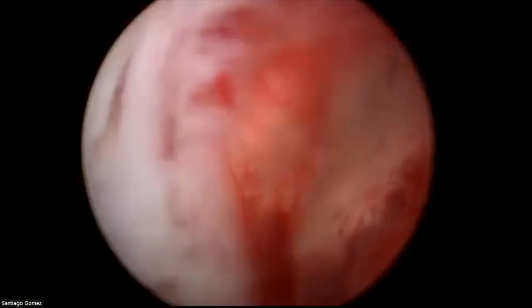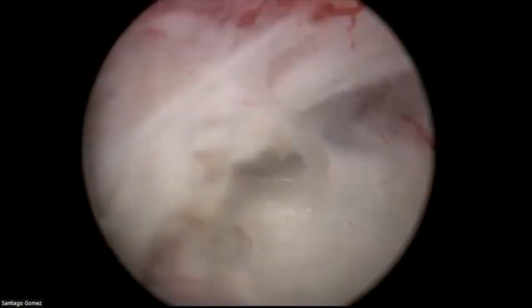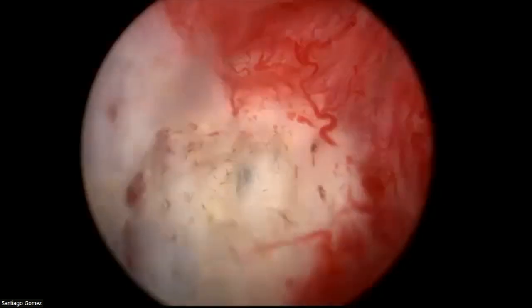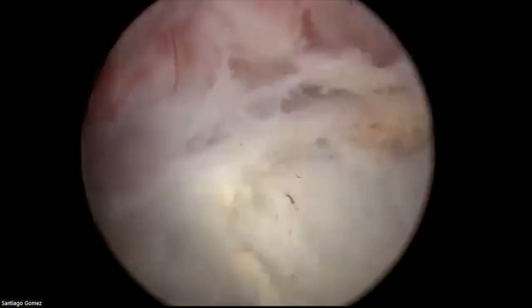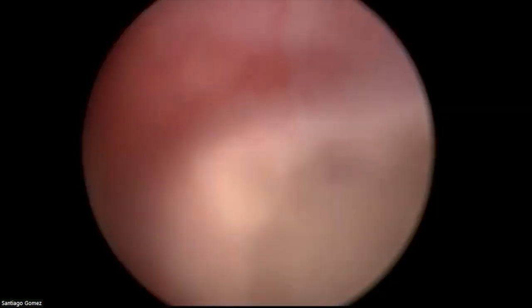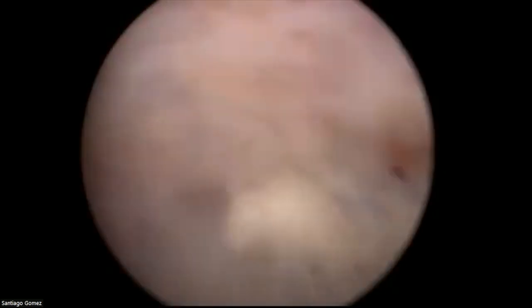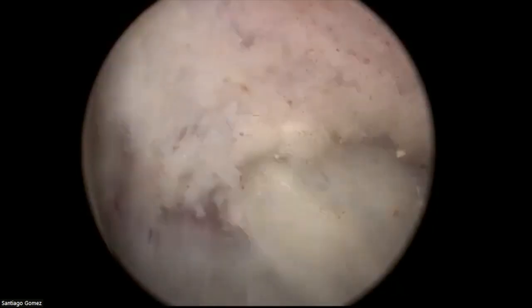Here, this is the apical side of my white line, and here I will come to the floor of the veru again, you see, and I will try to enter again with these movements from side to side. You see here, I think the scope probably helps a little bit as well, but it's a fast entry into the plane, initially on one side and then on the other side.